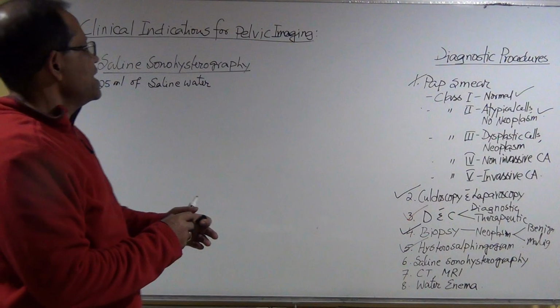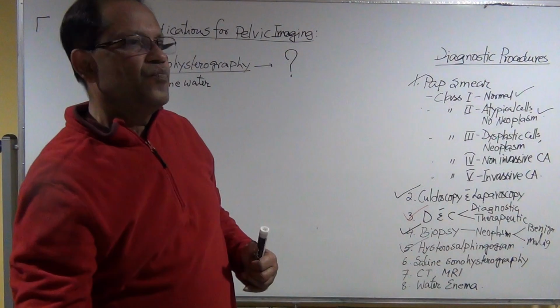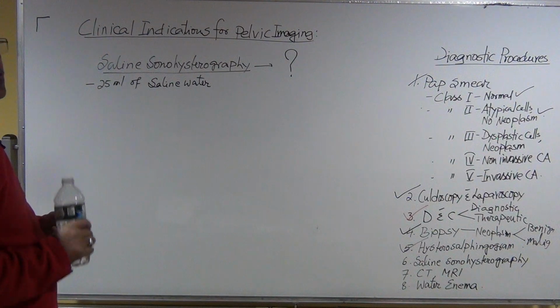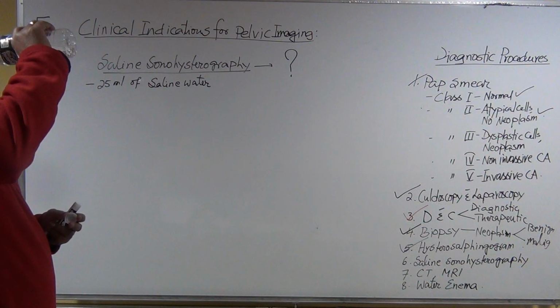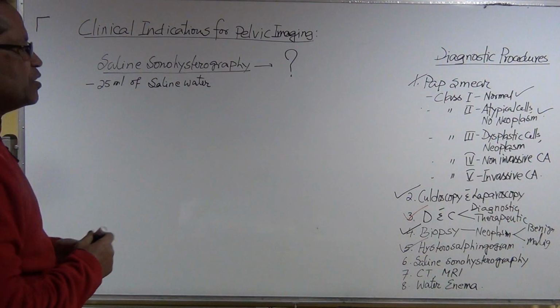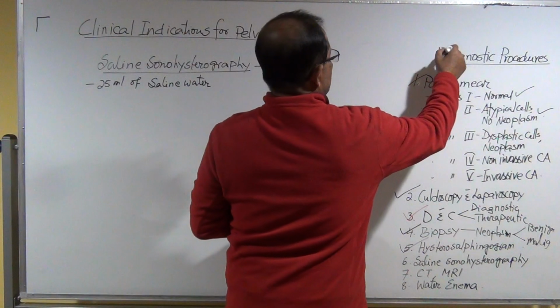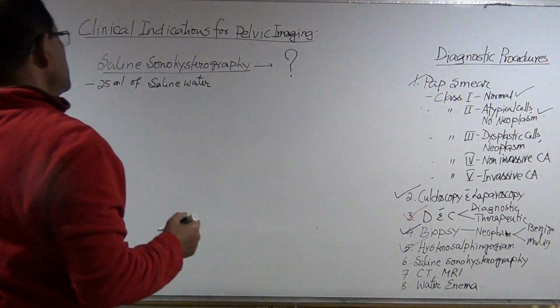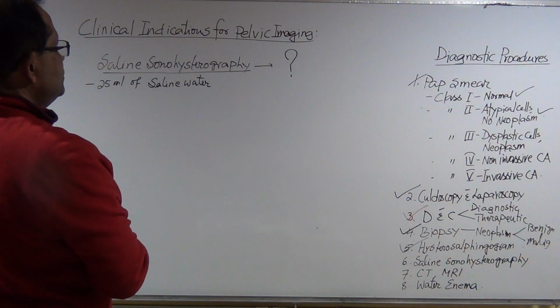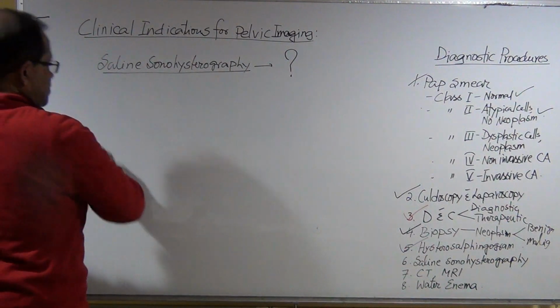Now question, why? Why does a patient need this saline sonohysterography? Very important question, and the answer is very nicely given. Okay, so now question, what is the indication of this? Okay, let me write down the indications, then I will discuss the steps.